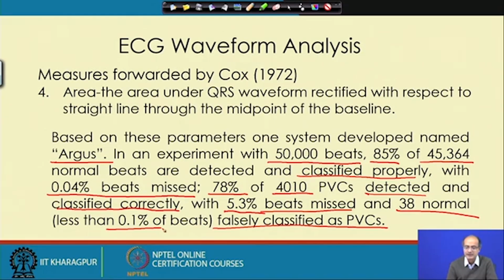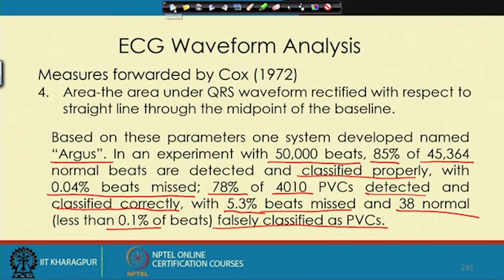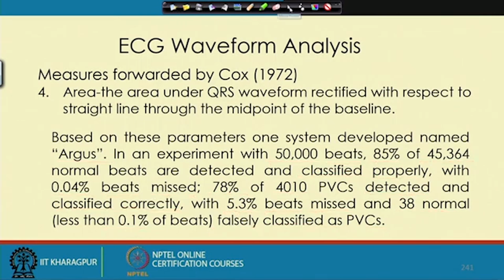We have just presented the strategy to take care of this, and how we can attempt to solve this kind of problem and design a system which can analyze the ECG signal, and thereby separate out the different kinds of signals.